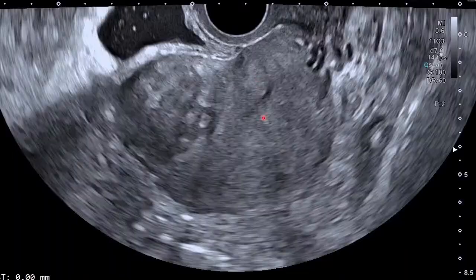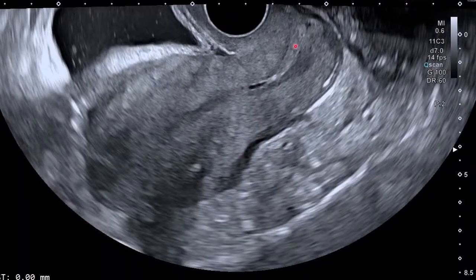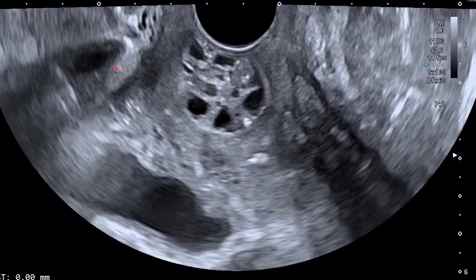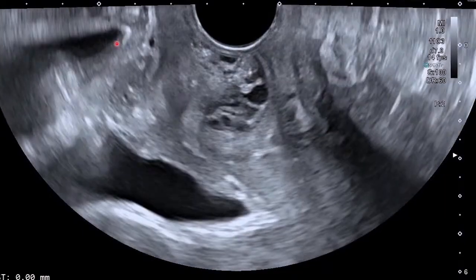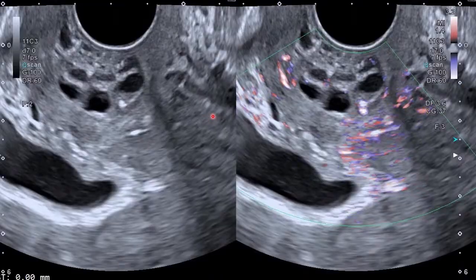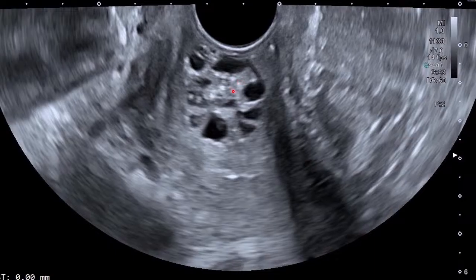Yeah, this was a straightforward diagnosis. Do you know what? Yesterday I did the same patient, a transabdominal sonar. I just reported on the serosal fibroid, but I couldn't pick this one from a trans. So now the mass is presenting low.